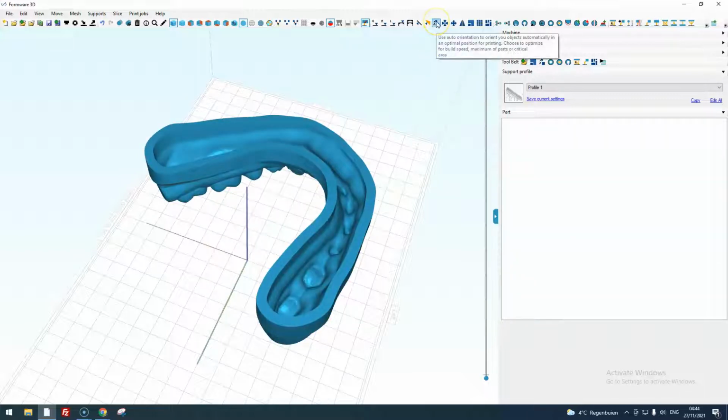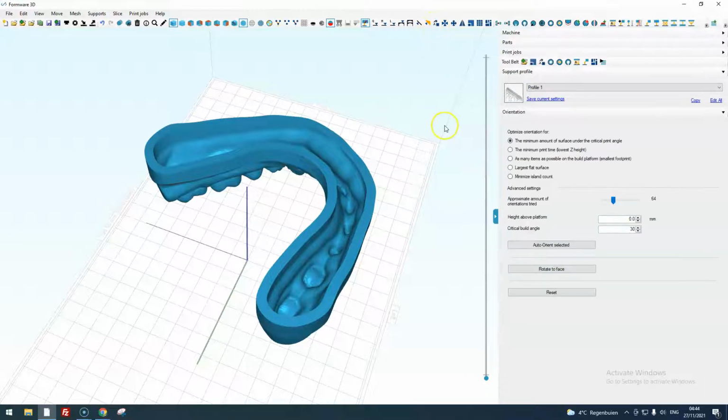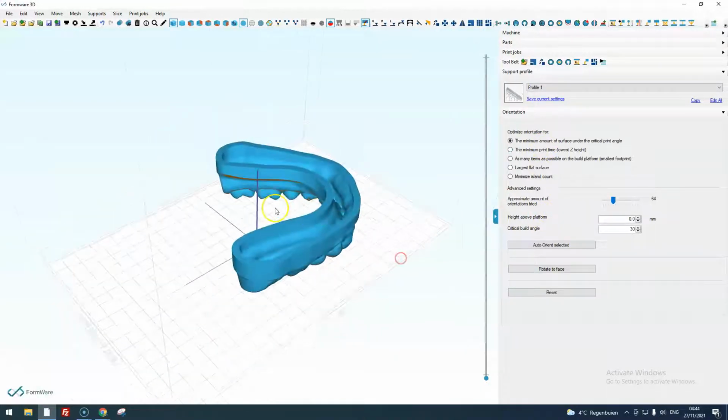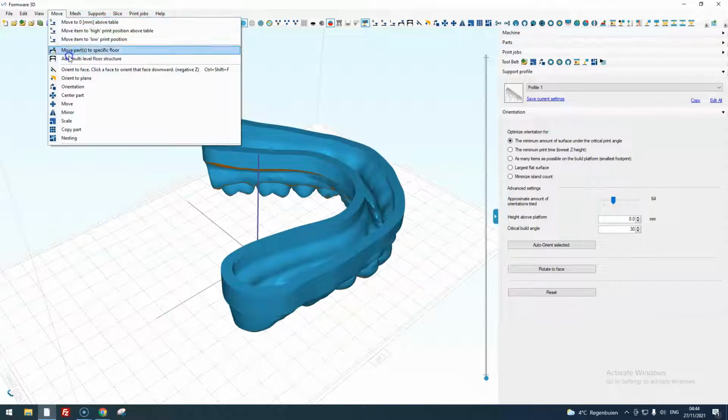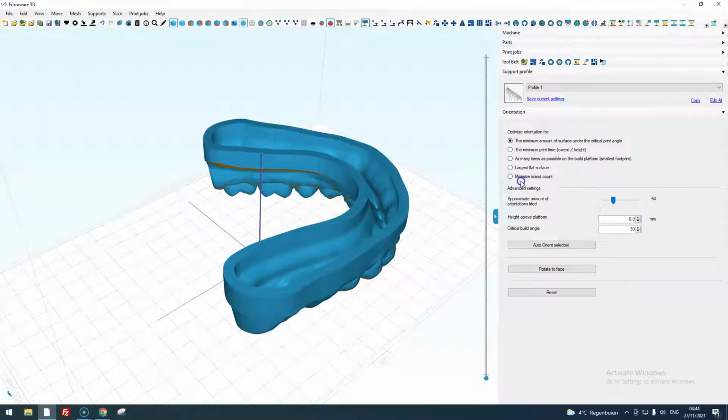Now, both of these were manual ways, but there's also an automatic orientation tool that has a couple of options. I will quickly go over them. So the auto orientation can be found here, but as well in the move menu. So it has five options.